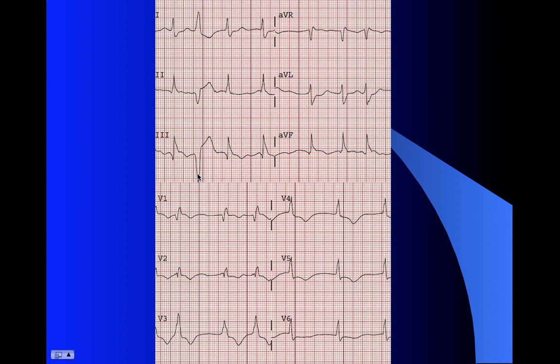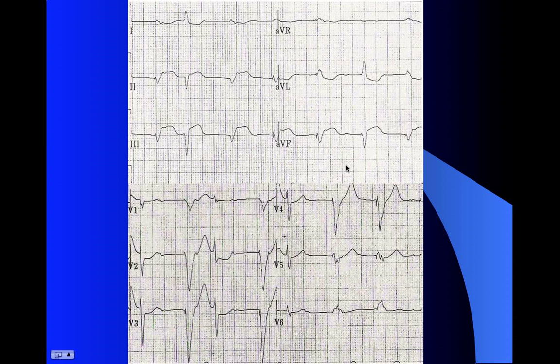So this is really jumping out at us as showing how even these ventricular rhythms, even this single PVC should still follow these principles that we saw in the Sgarbossa method. And this is in fact an early inferior MI. Now take a look at this one. This is a paced rhythm.